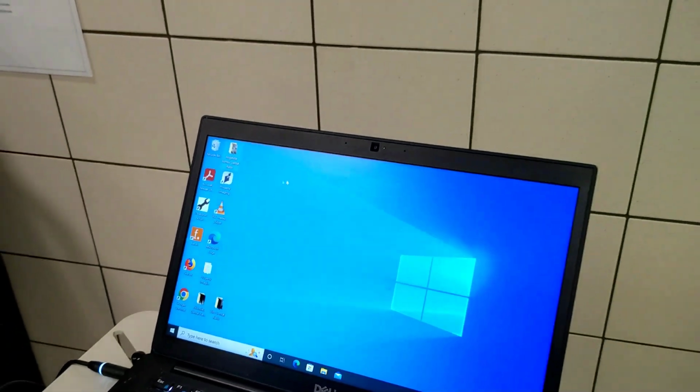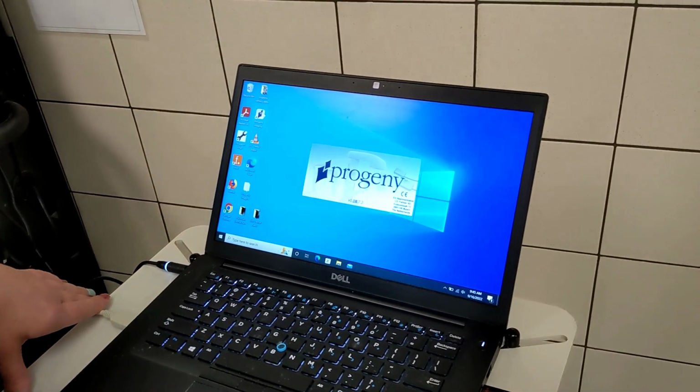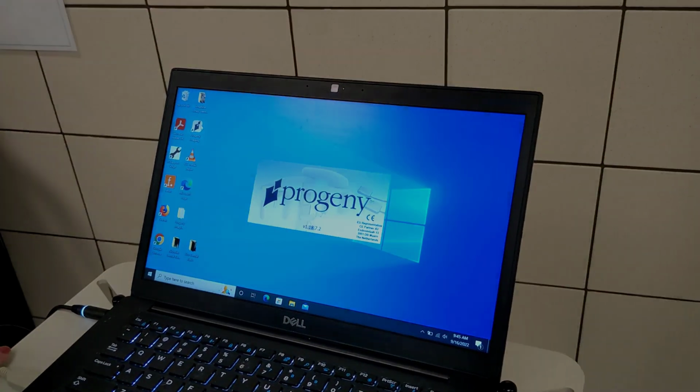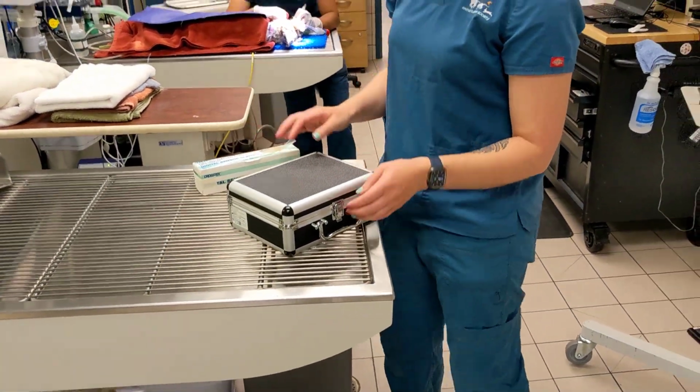Next, you will plug in and log into the attached laptop. After you are logged in, open and log into Progeny, which should be linked on the desktop. Once logged into Progeny, prepare the sensor, which should be stored in a protective case.